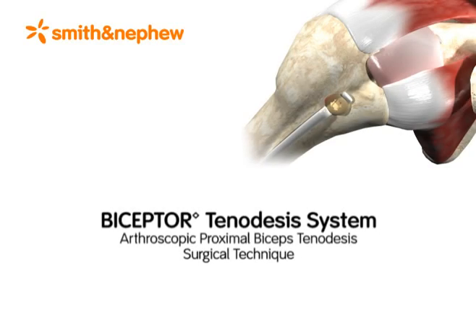The Smith & Nephew Biceptor Tenodesis System was created to provide a simplified procedure for biceps tenodesis. The Biceptor Tenodesis System does not require whip stitching the tendon, which means fewer steps for an all arthroscopic repair. The result is a strong repair featuring the Biosure PK Interference Screw.